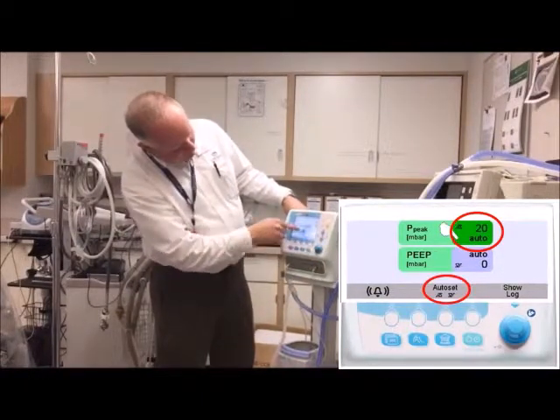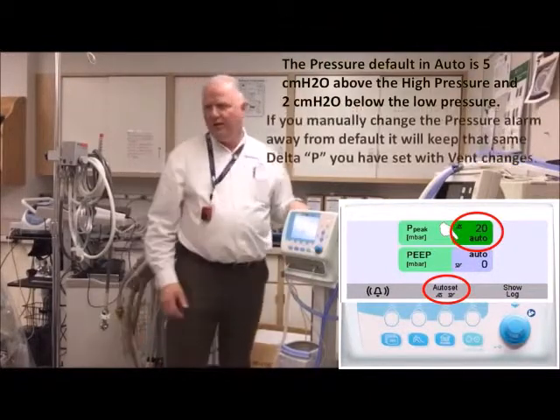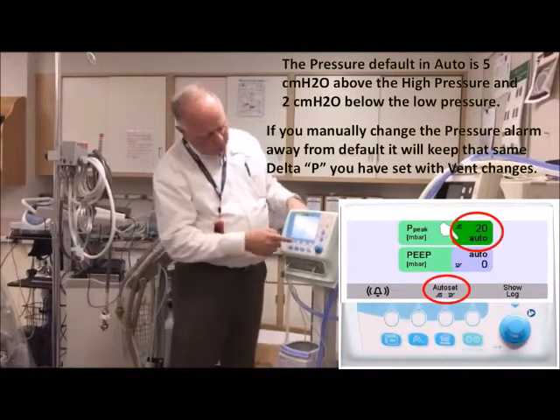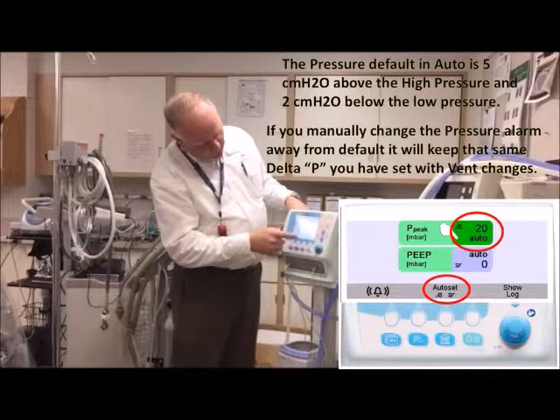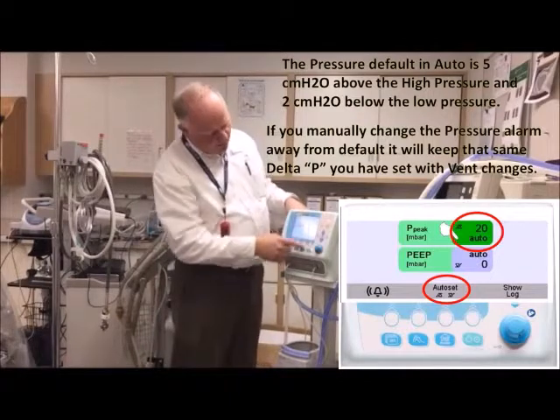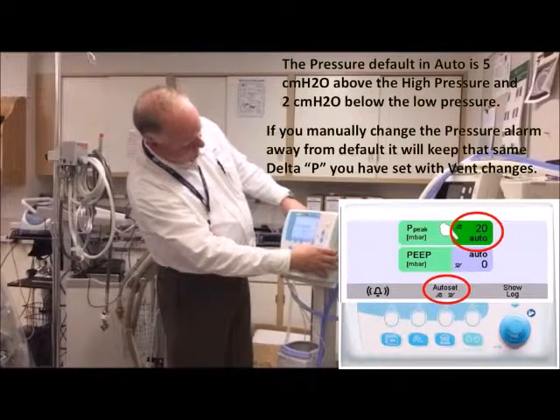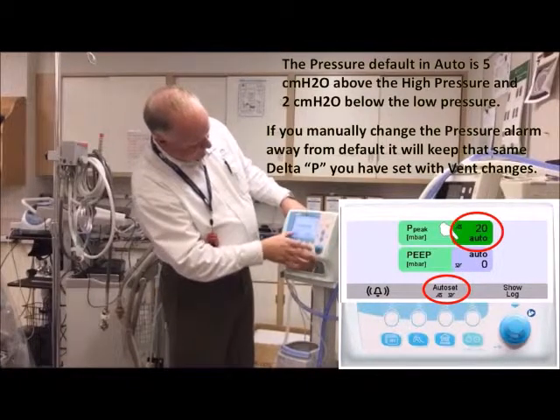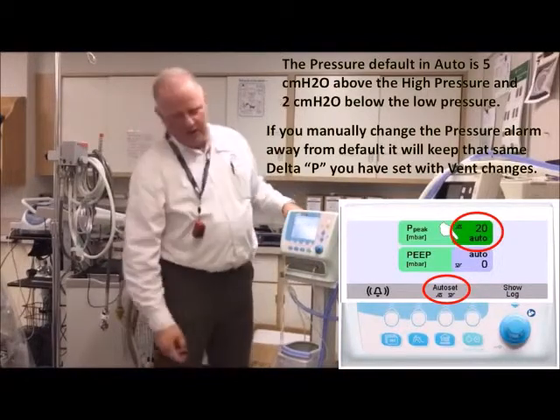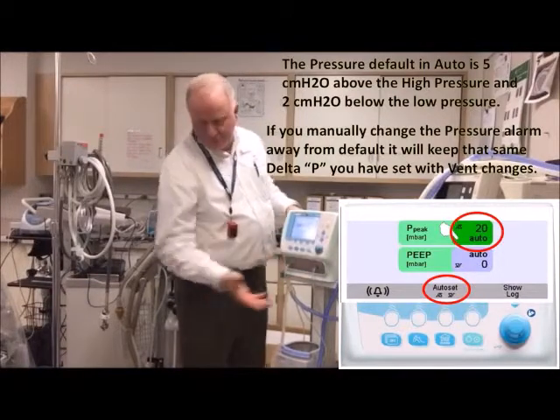In auto mode it might set at 12, but if you want eight or nine, you can change it down. You can tighten those parameters up if you want, or hit the parameter and hit auto set. If it's in auto, when you adjust your pressure setting, the alarms should adjust automatically as well. This gives you some quick settings to play with.